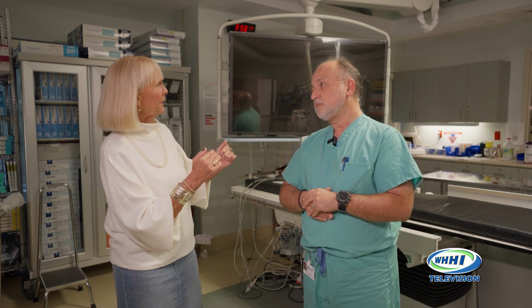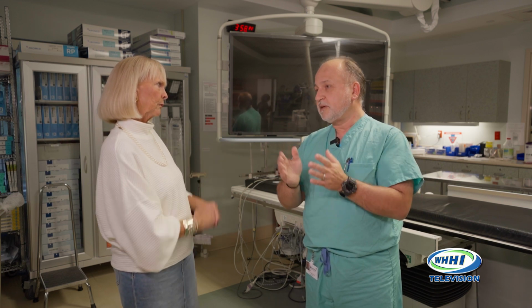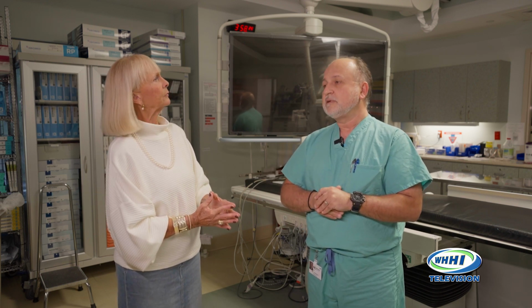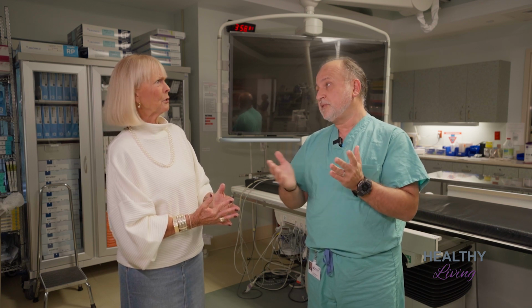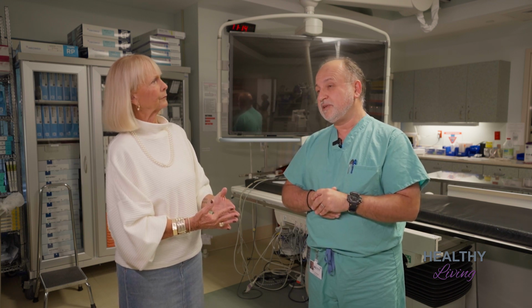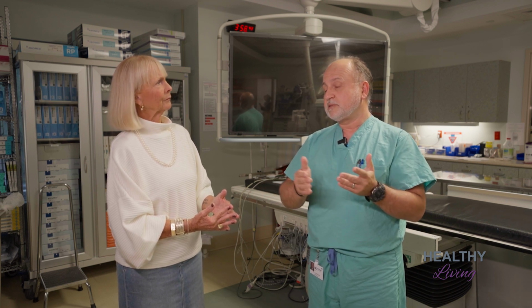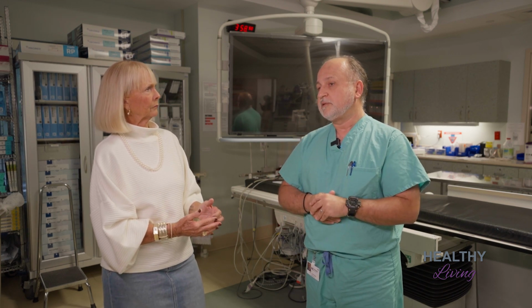Is it regulating the AFib, or is that done more medically and this is more? Great question. It does not regulate the atrial fibrillation. There's other procedures for that. But it will take away the need for a blood thinner. And there are many patients, huge. Absolutely, there are many patients who cannot be on blood thinners or find it very inconvenient. There's risk to the blood thinners, of course. Some patients are much more sensitive than others, and it gets to be a real problem. It's a very common issue that we've run into, and this provides an avenue to help.